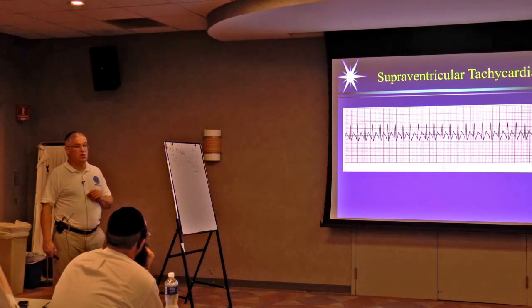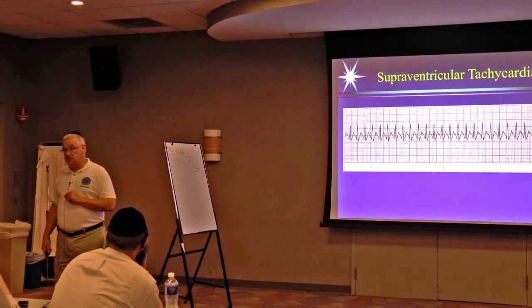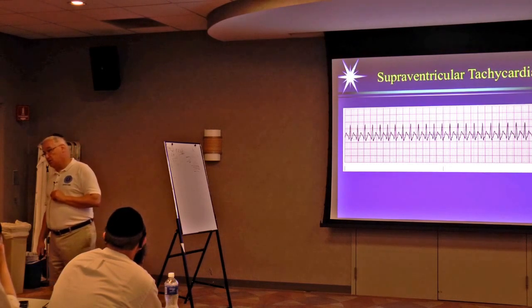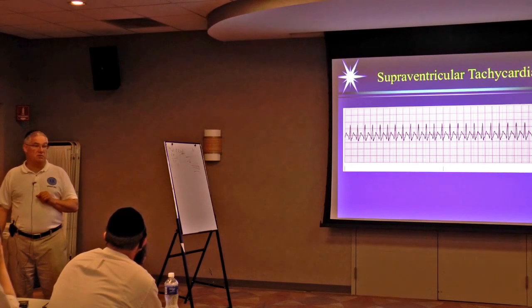Okay. So could you have sinus tachycardia that approaches 200? Yes, very rarely. 99% of the time in pediatric patients. Kids can have sinus tachycardia approaching 200, 220. Okay. Adults typically will not. The other thing would be history.